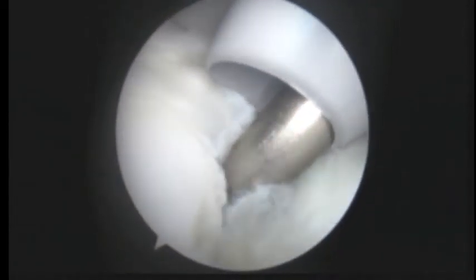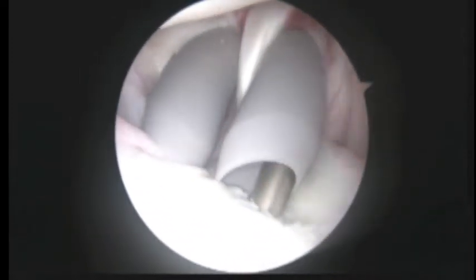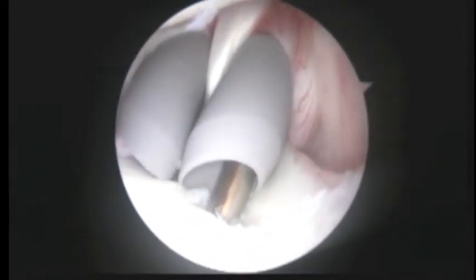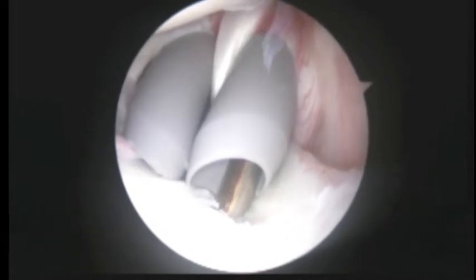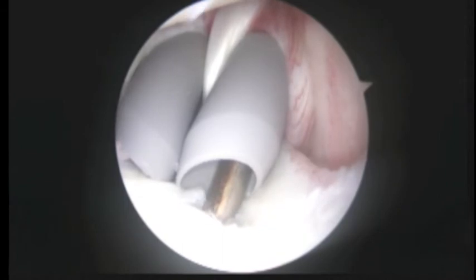Okay, we're placing another anchor. This one's actually metal. And this is to repair the biceps anchor. And we're gonna go ahead and unload this. This one's a little bit larger than the other ones that we've been showing you. Large enough that we can get two sutures through the eyelet. We're gonna be tying the white suture first.